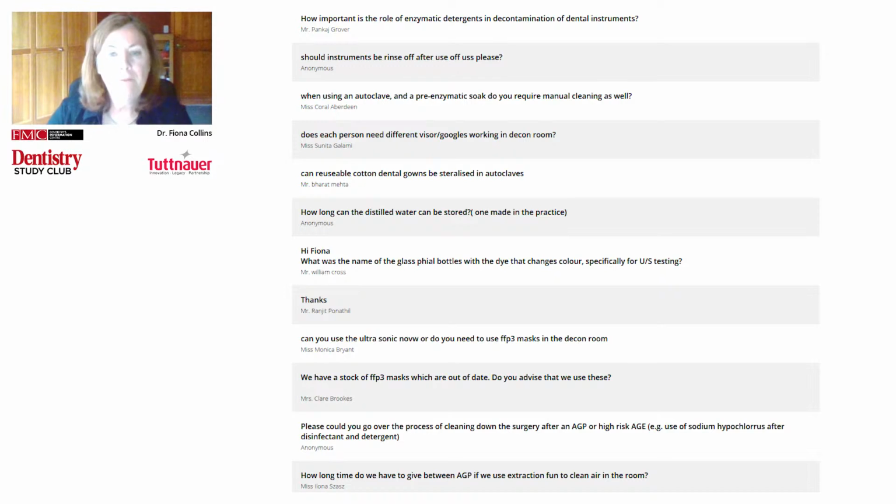Okay, if the washer disinfectors are designed to withstand repeated cycles, I didn't announce the question, my apologies. Washer disinfectors are always breaking down or are not financially viable, so surely ultrasonic should be good enough even for a new practice in England. What do I think? It's not really what I think. I told you what the recommendation is in HTM 0105, that it's advised to fulfill best practices.